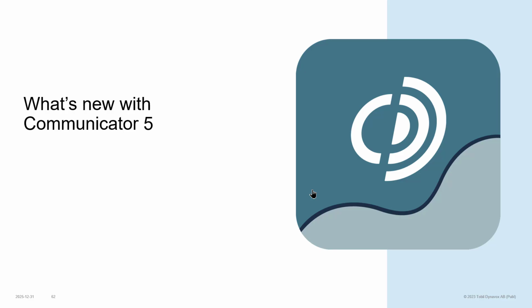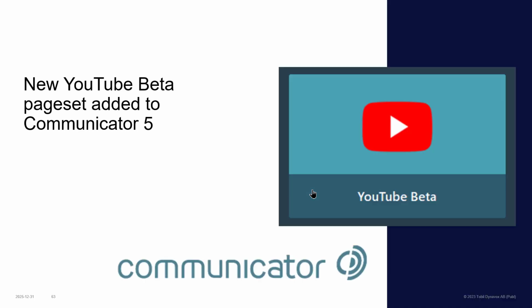Okay, so that's voices. So we're going to look now at what's new within Communicator 5. And there's just a small addition here. And this is a new YouTube beta page set added to Communicator 5. And it's built around the principles of TD Browse.